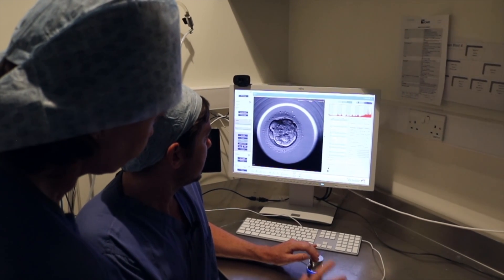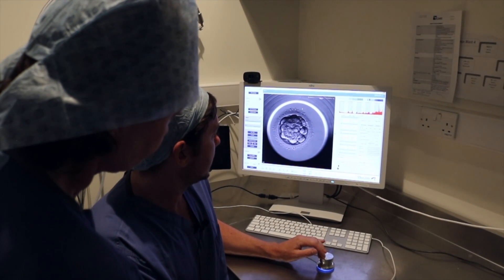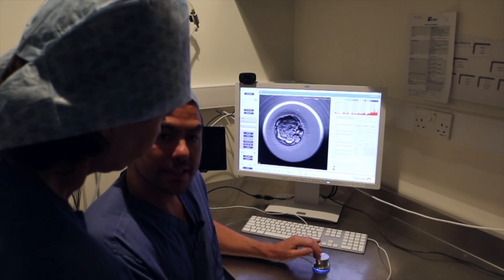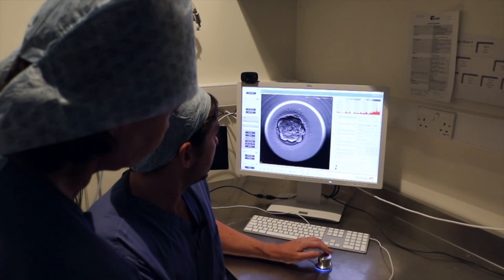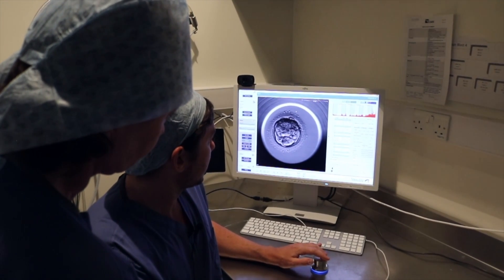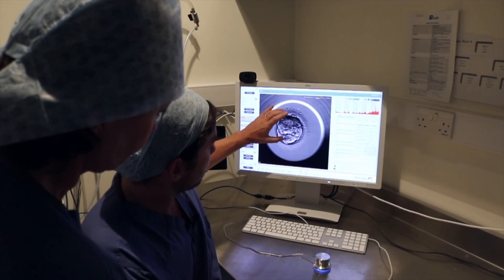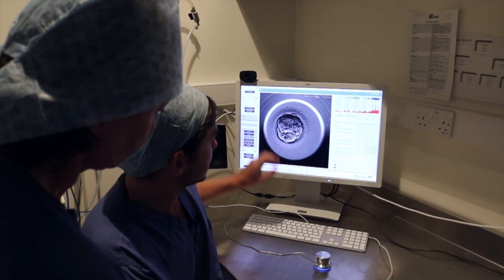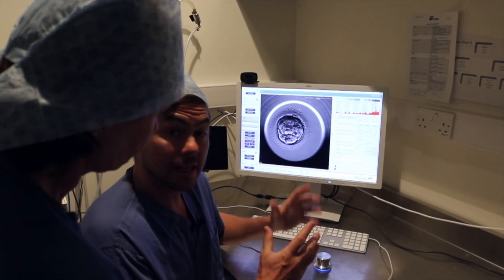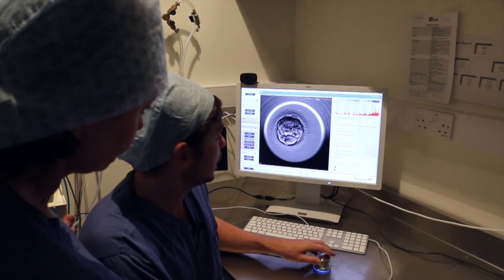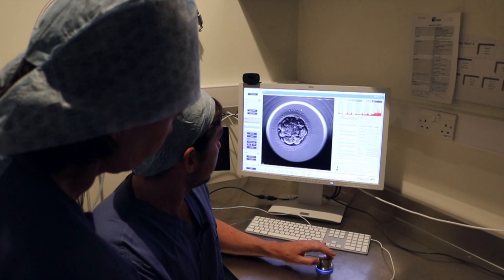This embryo is now called a morula and as it's developing it's starting the transition to a blastocyst. We know when the blastocyst starts developing because all of these cells start pumping fluid into the middle of the cavity of this embryo, and what it does is it blows up like a balloon, which it will start doing now.